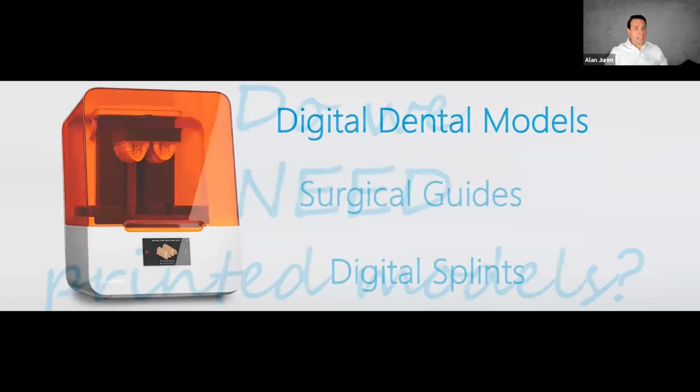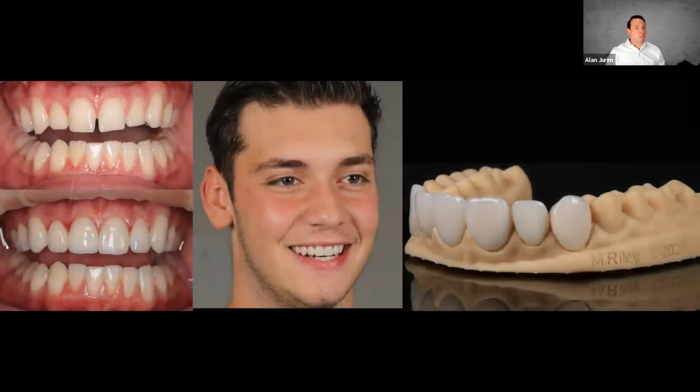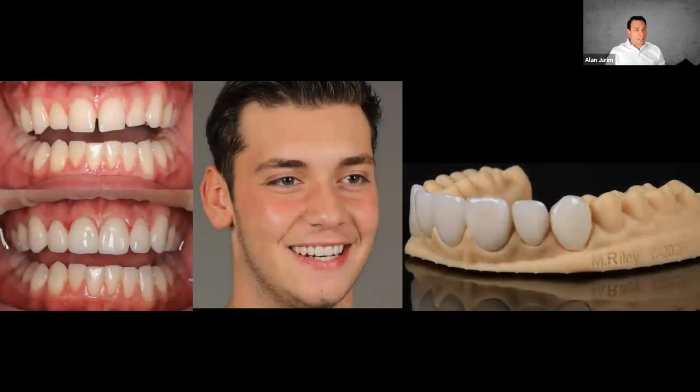So getting more into digital dental models, the first question I always pose is, do we really need printed models? When do we need printed models? A lot of times when we do cases, aesthetic cases like what we see here, so this is 6 anterior veneers we're doing for a young patient, the main reason why we will produce a model for a standard case like this is twofold. One is for a technician to be able to actually have a model where they can put a unit on where they're going to hand build porcelain up.